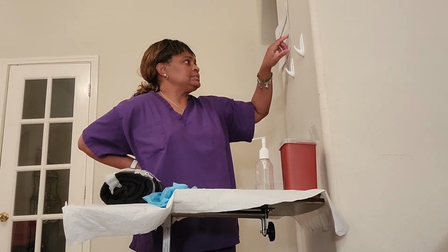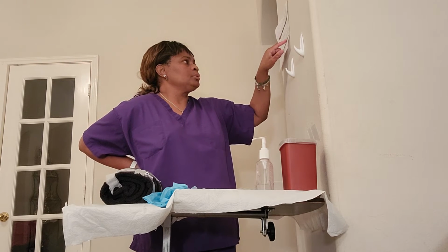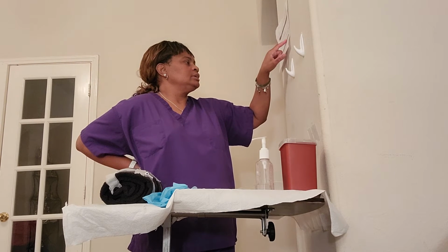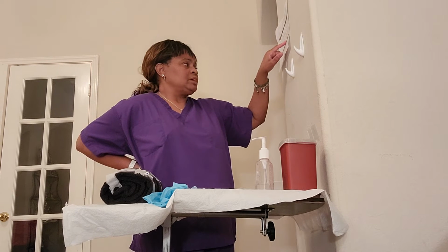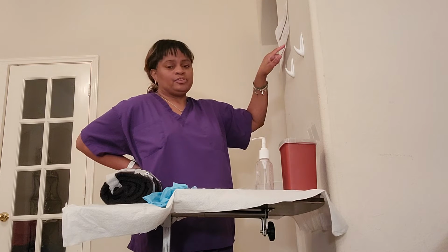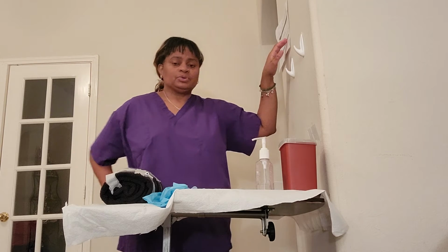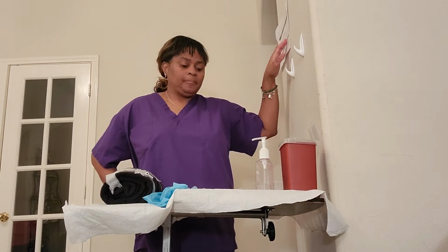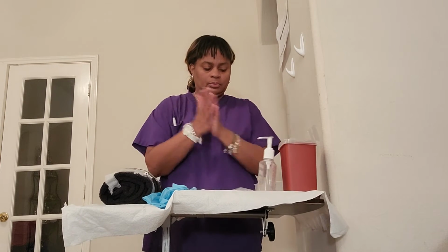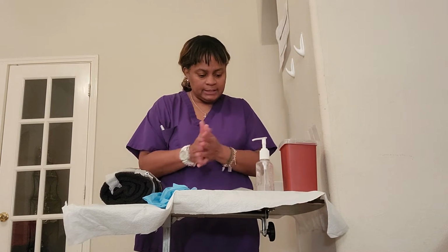What we're administering at this time is going to be the 500 milliliter 0.9% sodium chloride, or normal saline, at 125 mLs per hour. The drop factor here is 10 drops per ml. The time to administer it is now, and it is for rehydration or dehydration. So my drip factor is going to be 21 drops per minute. Okay, so that is my first check. I've gathered all my supplies.